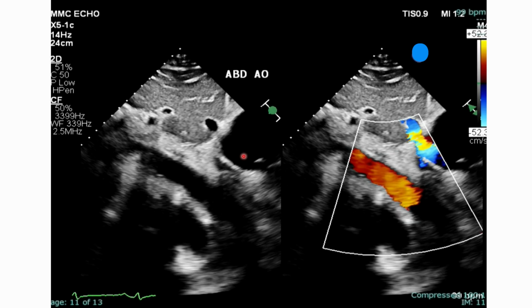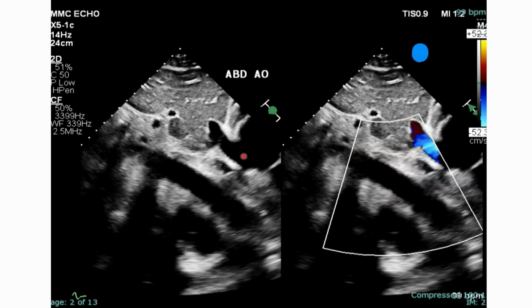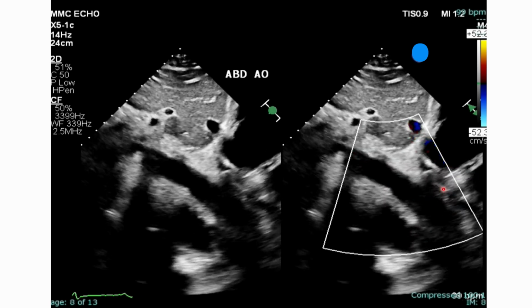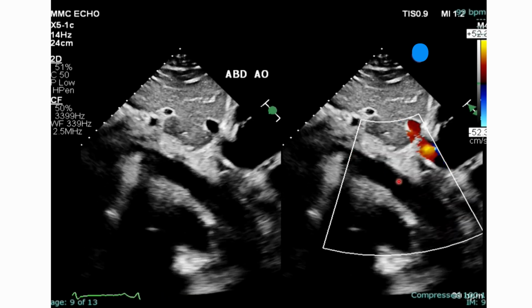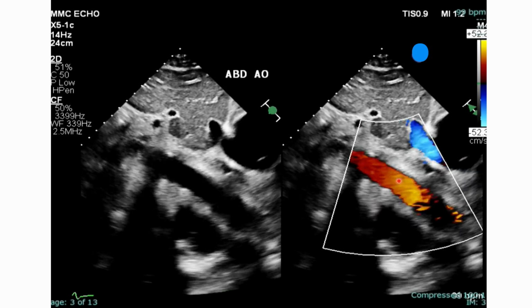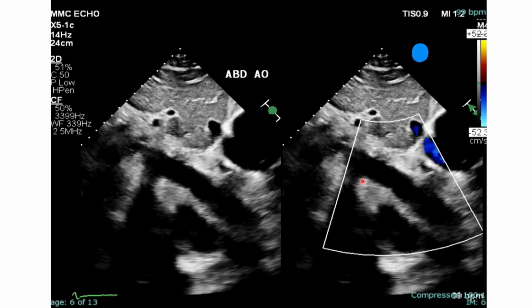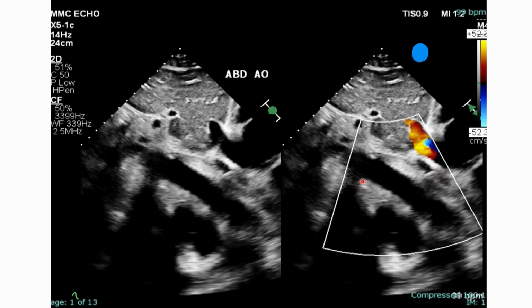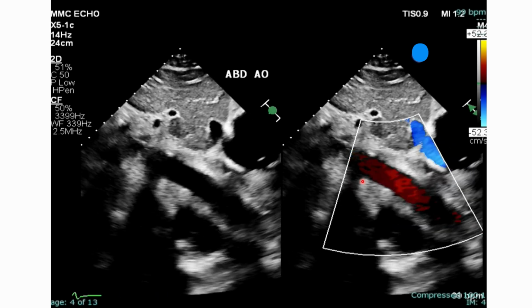And one of the things that we look for differently was if there is significant aortic regurgitation, we look to go in the abdominal aorta, if we can, and just see if there is holodiastolic reversal in the abdominal aorta. You just think about, there is so much AI that it's dumping back into the left ventricle. It's pulling all the way from the abdominal aorta. That's going to be significant.